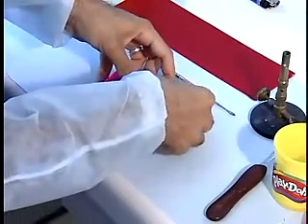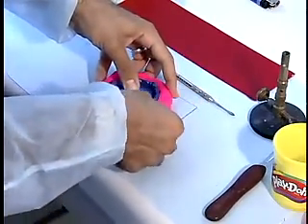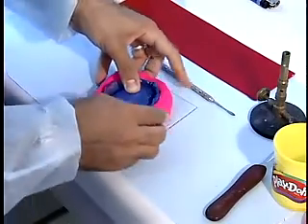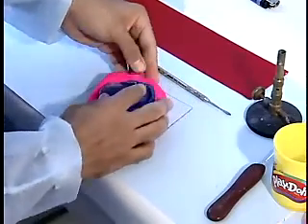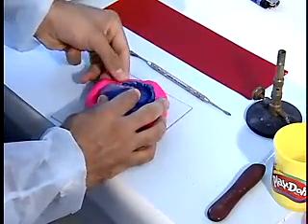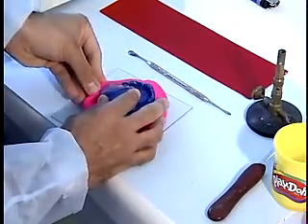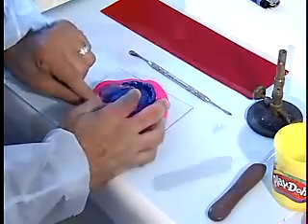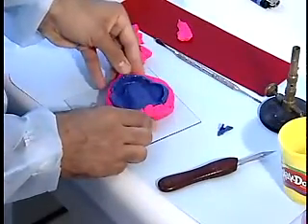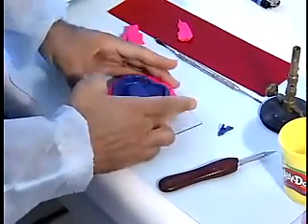Try to seal around the impression using a wet finger. About 2 to 3 mm of the impression borders should be visible, superior to the Play-Doh, and all the tissue surface should be Play-Doh free. Again, use a wet finger to smoothen and seal the surface of the Play-Doh.